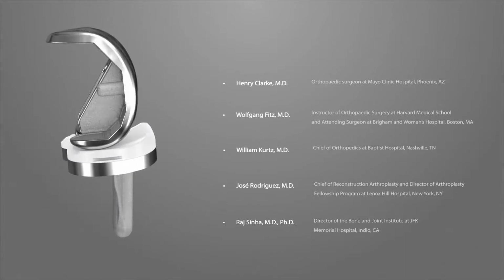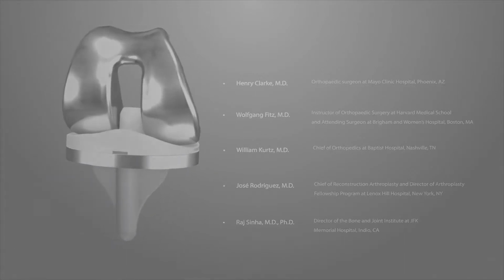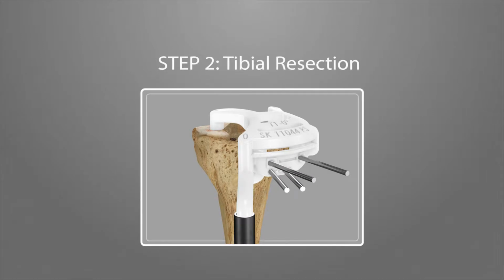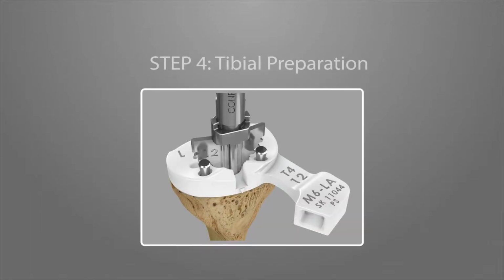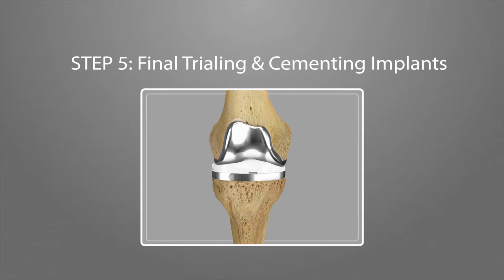The accompanying patient-specific disposable iJig instrumentation is employed in the following five steps. Distal femoral resection. Tibial resection. Femoral preparation. Tibial preparation. Final trialing and cementing implants.